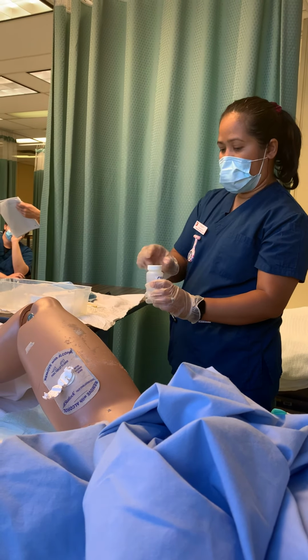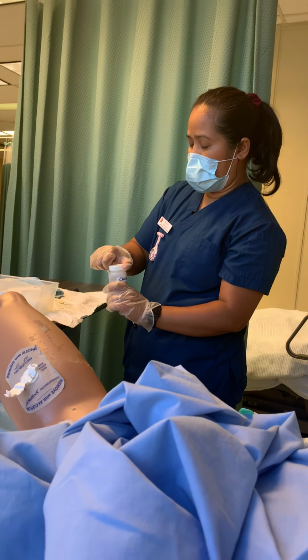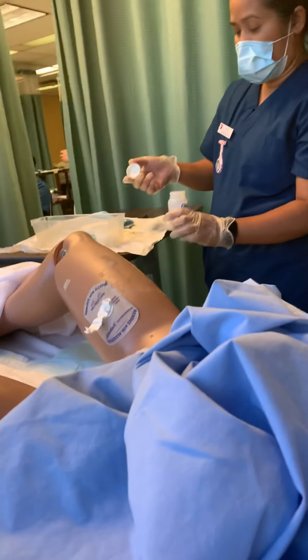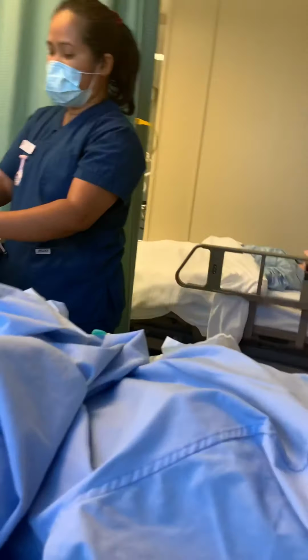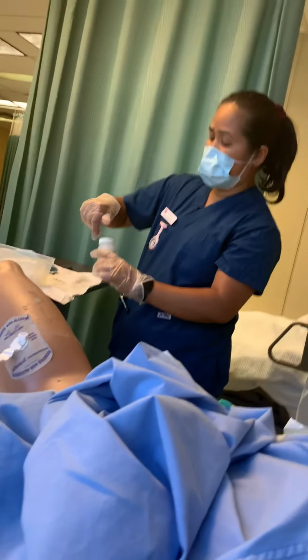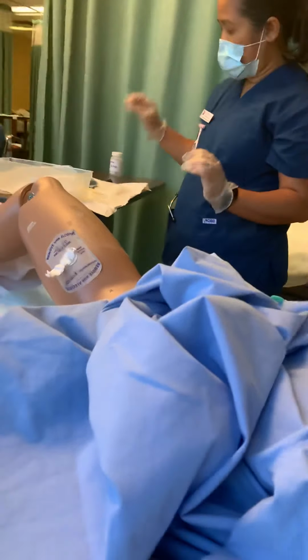Open it and check for the expiration date. For chlorhexidine, it's going to be 28 to 30 days. Always check thoroughly if there are any abnormalities, or if it's dirty. You can pour a little bit in the garbage too. Then pour a little bit, not too high, not too low. Do not make your sterile field wet. And then set aside.